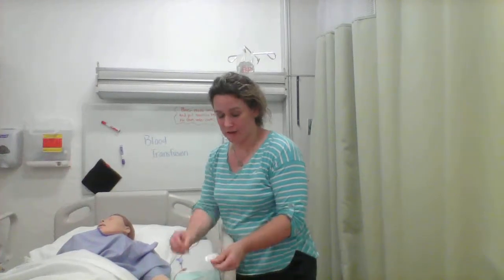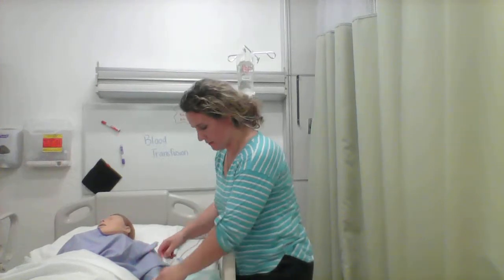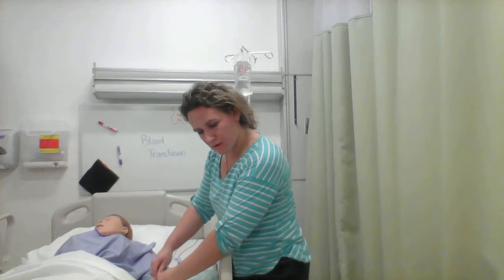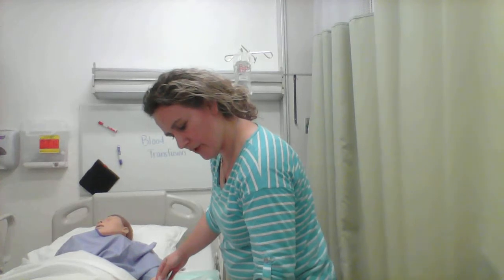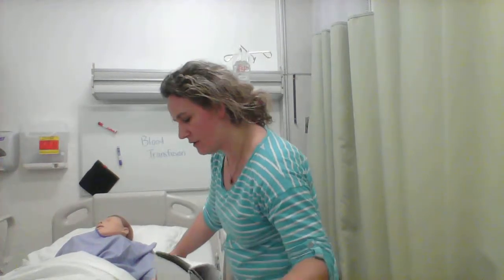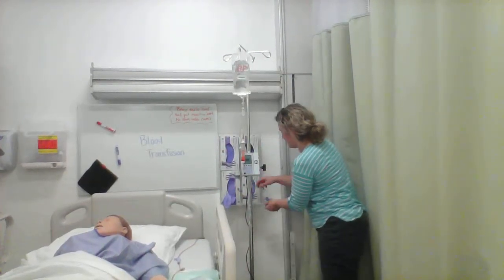And it looks good. So we're going to go ahead and scrub the hub for 20 seconds. I wonder if I have to have gloves on during this part. I think we should.